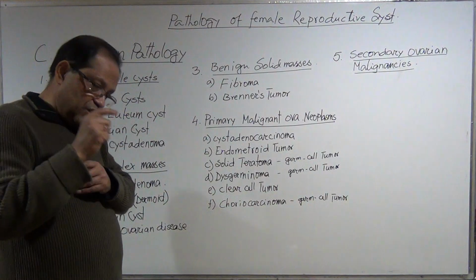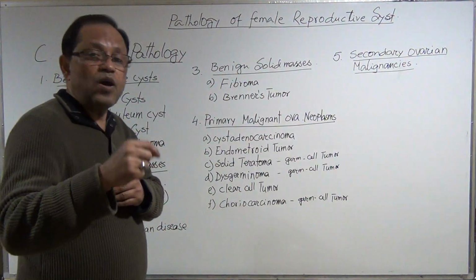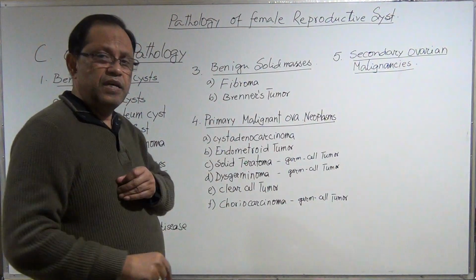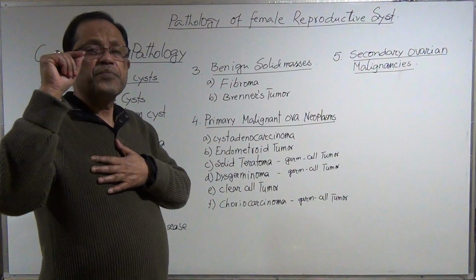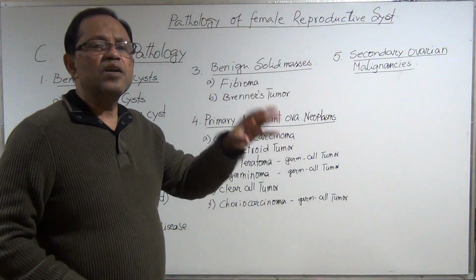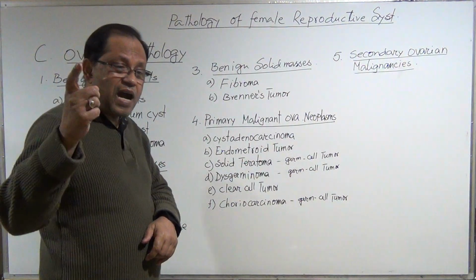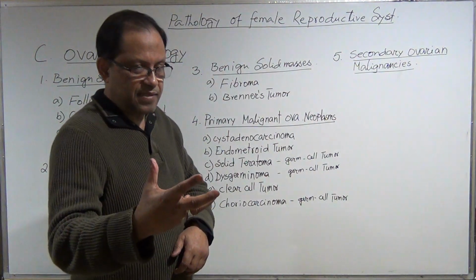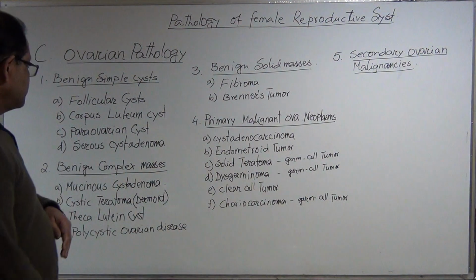During the ultrasonography, you need to evaluate it, whether it is inside the ovary or not. Okay, do I need to click the color? Yes, it is my policy. Whatever suspicious, it could be cystic, then solid, complex, simple, doesn't matter, I always click the color. Because sometimes color appearance can isolate a mass is separated from the organs. Okay, so that is important.